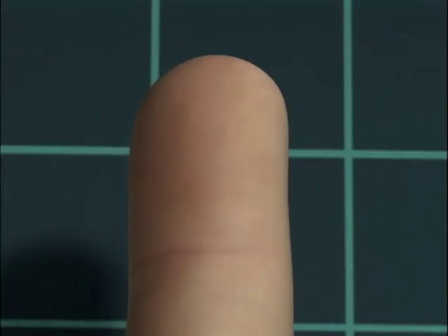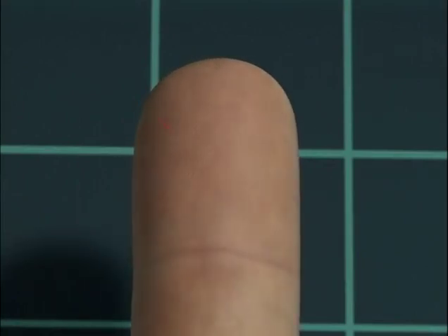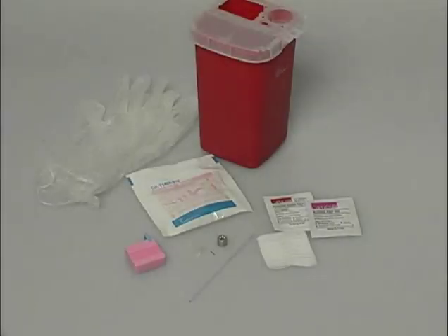Since the flesh on the pad is twice as thick as the flesh on the sides, puncture the pad of the fingertip rather than the sides. The puncture should be across the fingerprints rather than parallel to them to prevent blood from channeling away from the puncture site. Supplies include gauze, disinfectant, a skin puncture or incision device, warm compress or commercial heel warmer, heparinized capillary tube, a metal flea and magnet, a cap or other sealant, gloves, and a sharps container.